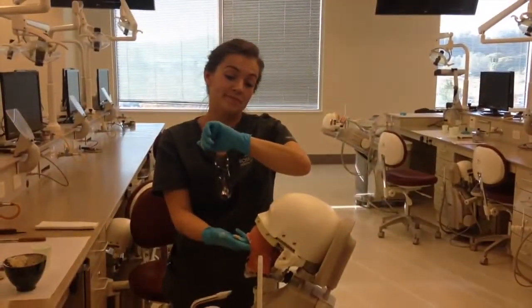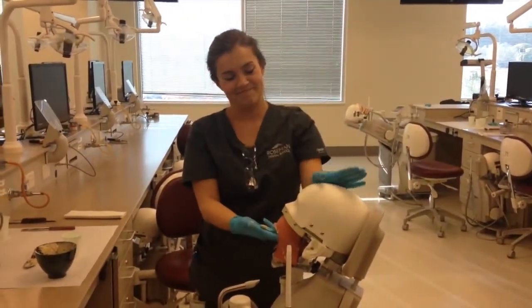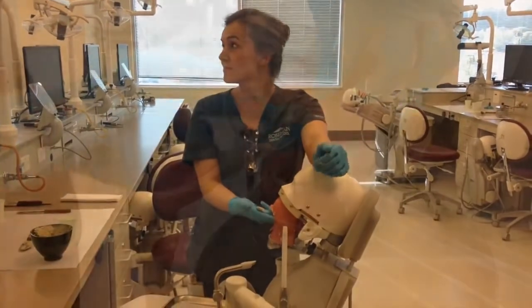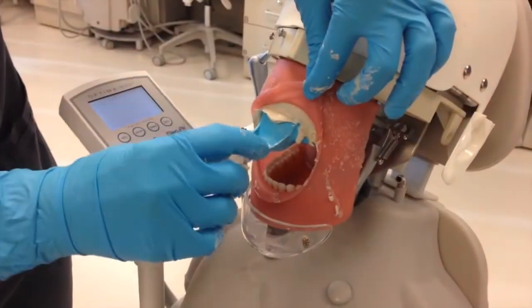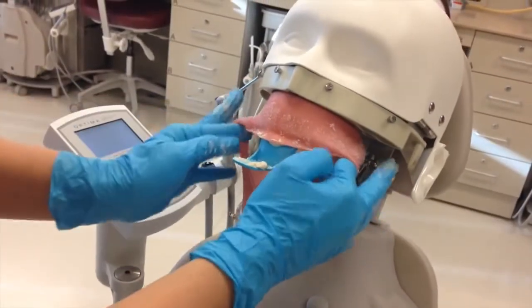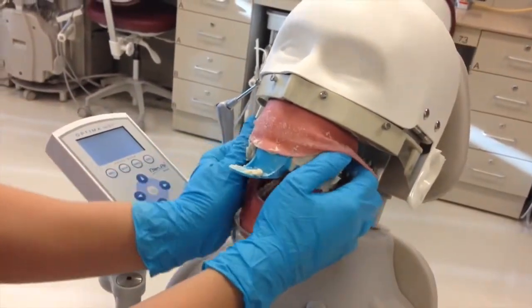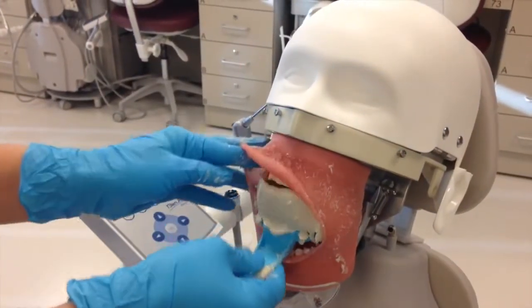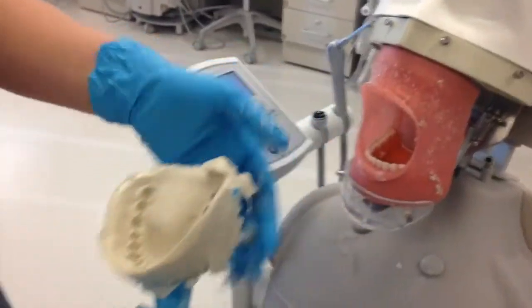Time to wait. Is the alginate firm? Perfect — you can remove it. Pull gently on the back of the tray and remove it from Darwin's mouth. Be sure to give him a paper towel to clean up with afterward. His face sure is messy.